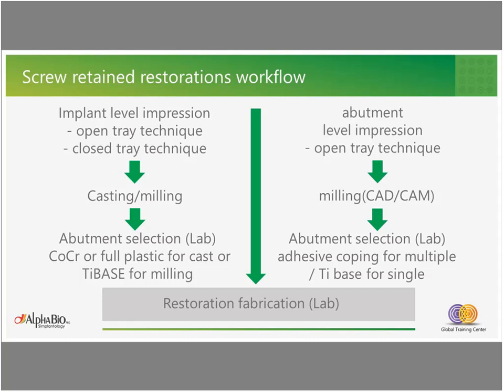And then we can also ask the technician or the lab to make the restoration using the CAD/CAM techniques. And in most cases, it can be done using a special abutment called Ti-base abutments. This abutment is used in order to connect the restoration to the implants, and it can also be a possible way to do that. Instead of taking the impression from the abutment level using the standard techniques of impression taking, we can make it also by using digital.